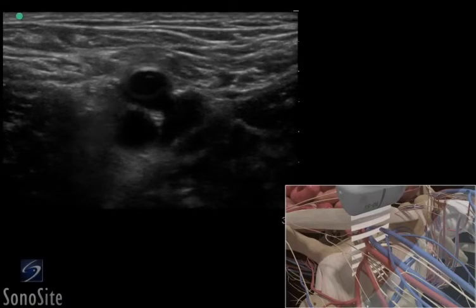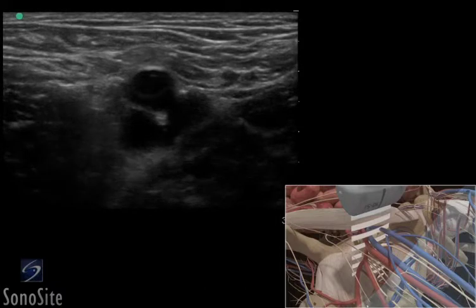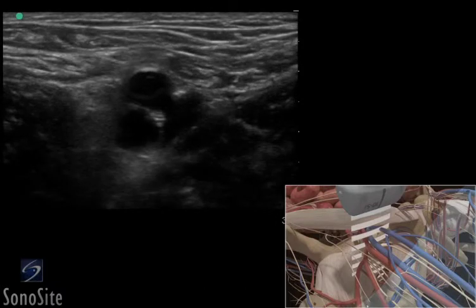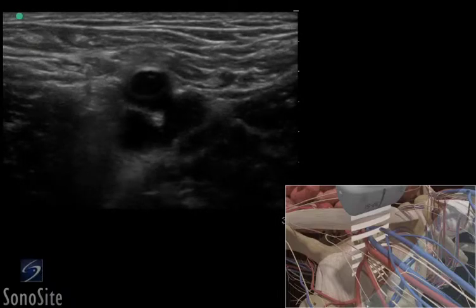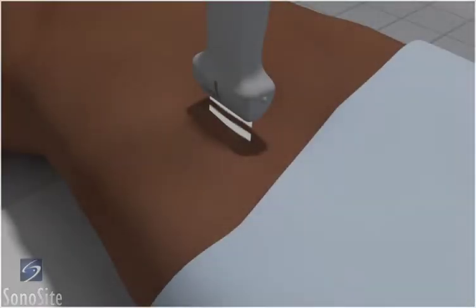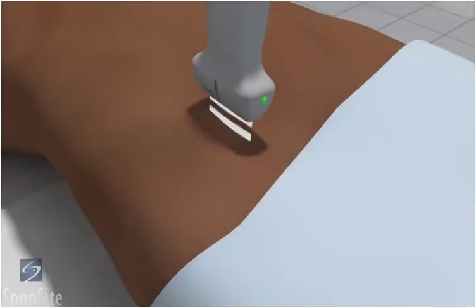A linear array transducer with a vascular exam type is used to perform an ultrasound-guided insertion of a femoral artery catheter via a transverse approach. The patient is in a supine position with the operator at the right side.